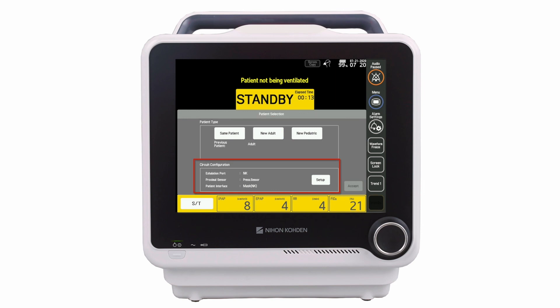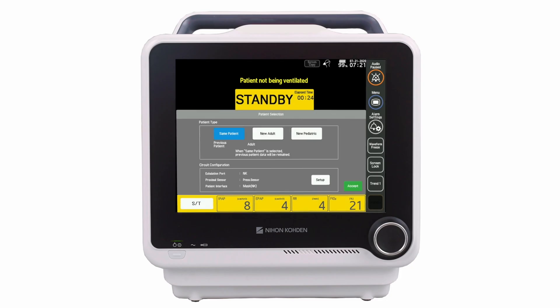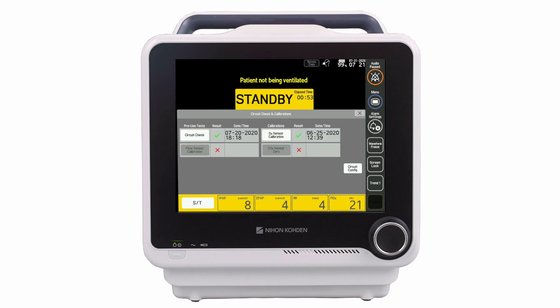To change the circuit configuration, press the Setup button, then select the appropriate choice for exhalation port, proximal sensor, and patient interface. To close the circuit configuration window, press X. Press Accept to go to the circuit check and calibrations window. This window displays the current calibration status and allows the clinician to perform calibrations when needed. Press X to go to the standby screen.